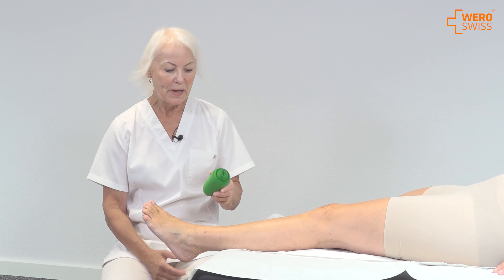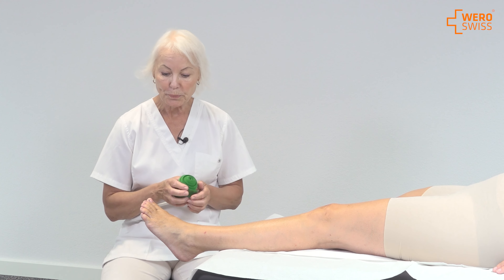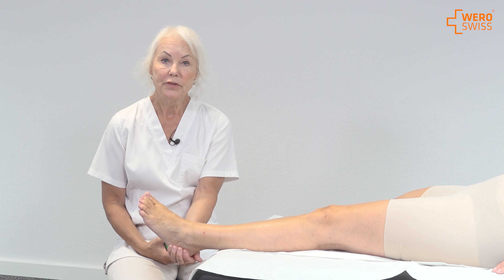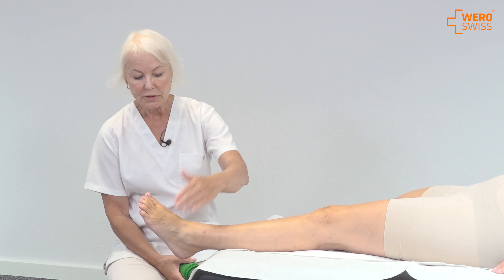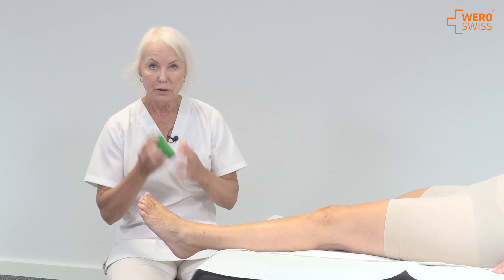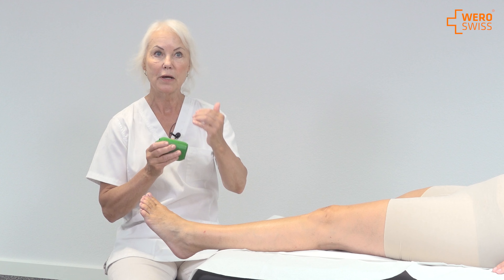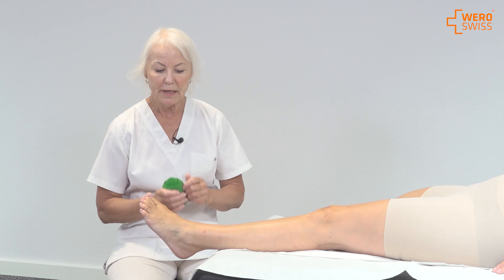Using the support bandage when you have an ankle problem — for instance, orthopedic injuries requiring this bandaging. I will cover the heel, and you have to consider if you have an injury on the outside or the inside. If you have it on the inside, you want the bandage to lift on the inside, and if you have it on the outside, you want it to lift on the outside. This is to relieve the pain and also to stabilize.